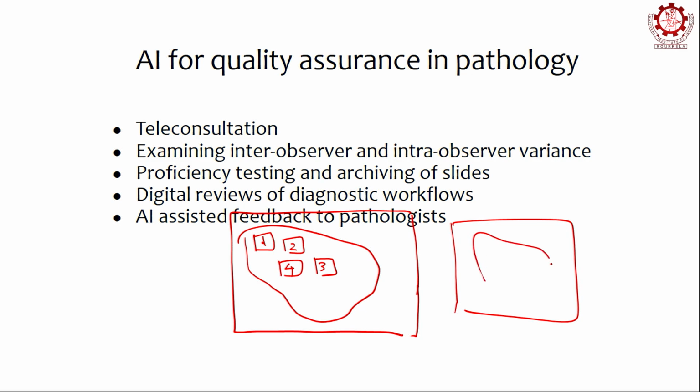This is the whole slide image. They would actually have this path saved, right. So that is how the pathologist moved around while looking at this image. This is nothing but connecting the centers of the fields of view, right. Now, typically in many of these clinical workflows, junior radiologists or junior pathologists would make the diagnosis, and these have to be reviewed by senior pathologists.